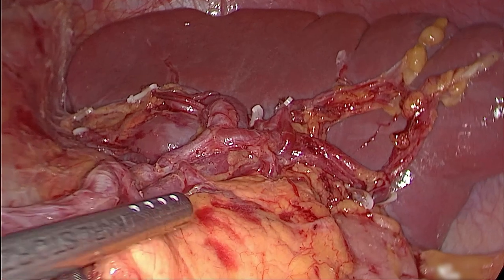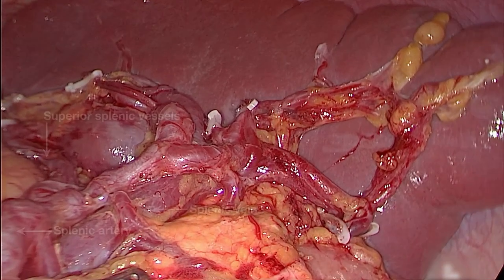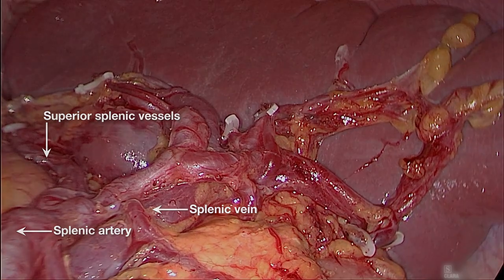Until now, the number 10 lymph nodes have been completely dissected. This is what we call the laparoscopic spleen-preserving number 10 lymph node dissection in left approach.